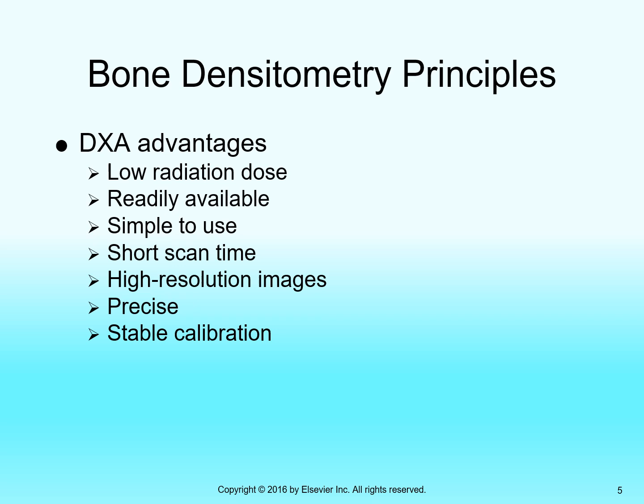it really doesn't use the image. It will give you a thumbnail image on some of these, but it really doesn't report an image as much as it does report the numbers, the statistics about that image, the difference in attenuation, and the mathematical adjustment of that difference to calculate a calcium score or a density score.